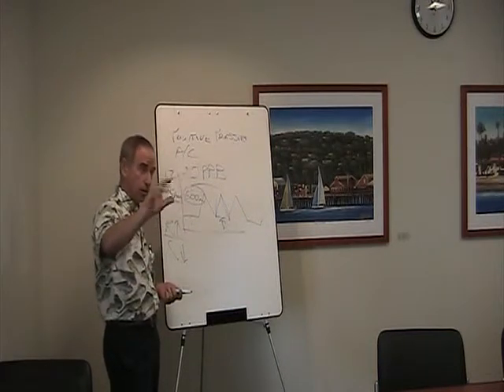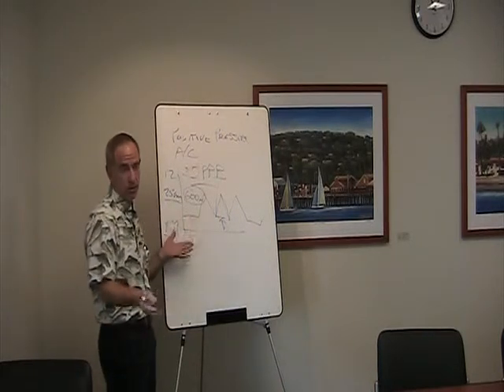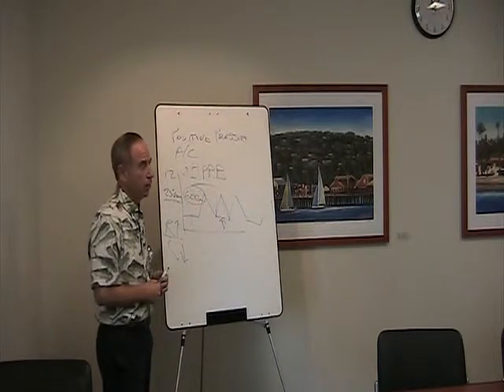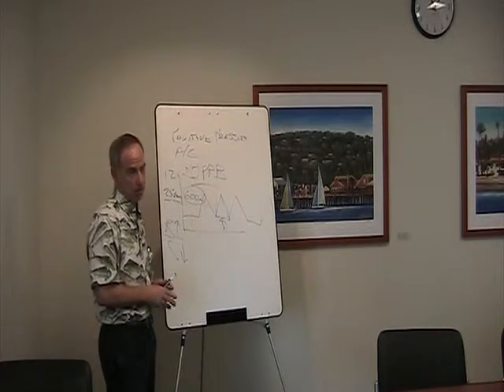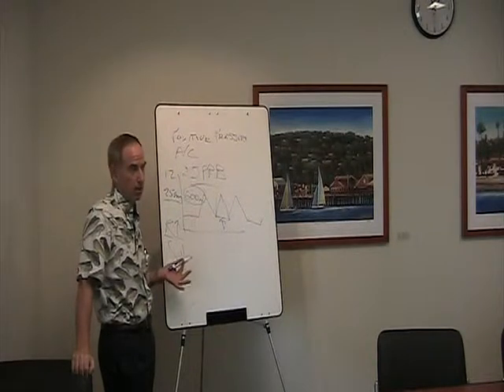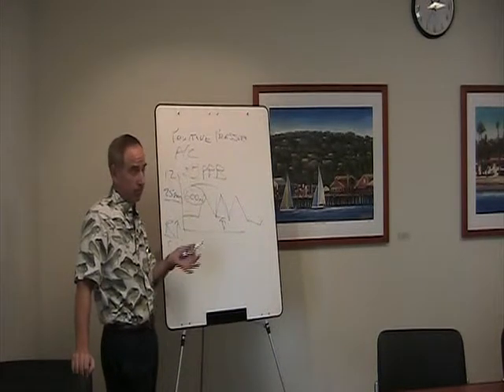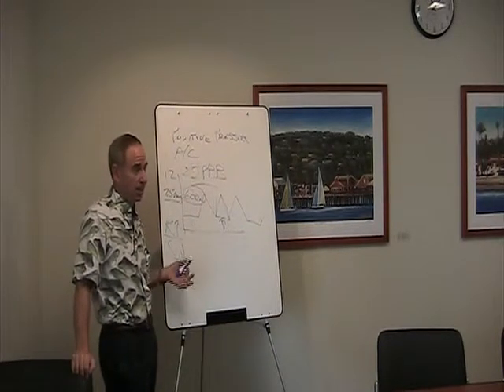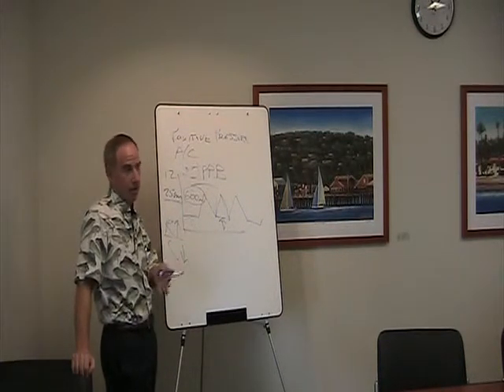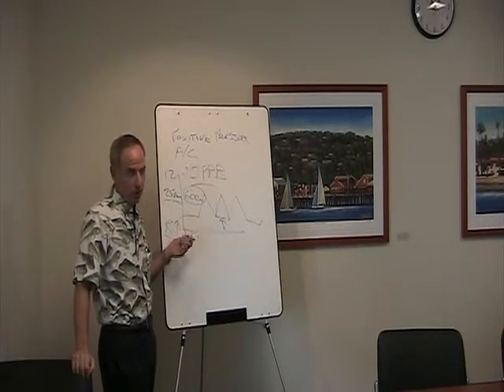They would tweak the pressure until they got the volume that you were asking for. And once they got that volume, they would just leave it at that pressure, right? That's how you do it. There's no other way to do it. So they would set the patient up on these machines, and it worked fine for certain patients. If a patient came in with a drug overdose and no lung problem, just over-narcotized or sedated and not breathing, and they get intubated in the emergency room, you just wait for them to wake up and then extubate them, right? Those people usually did fine on this because there was nothing wrong with their lungs.